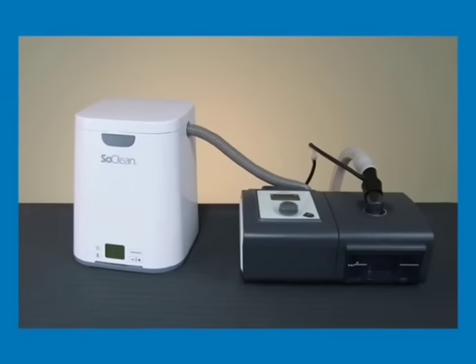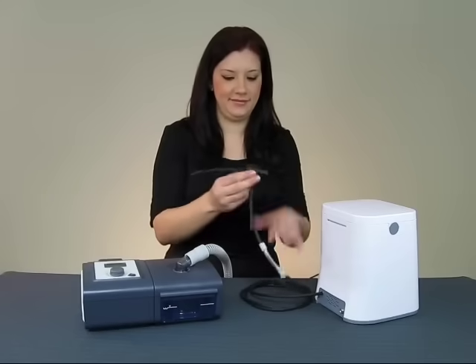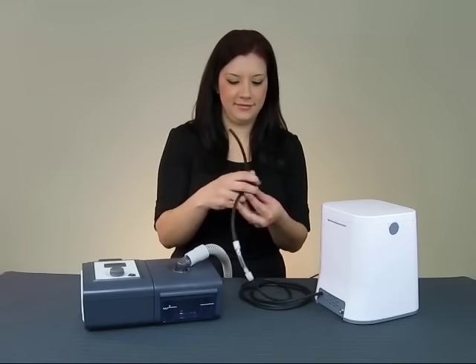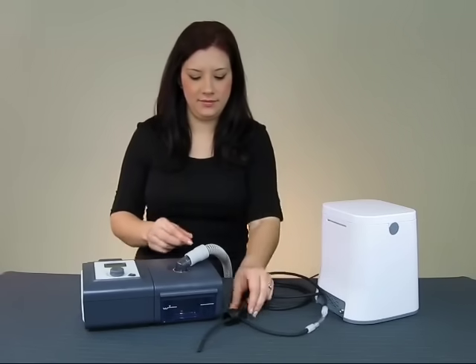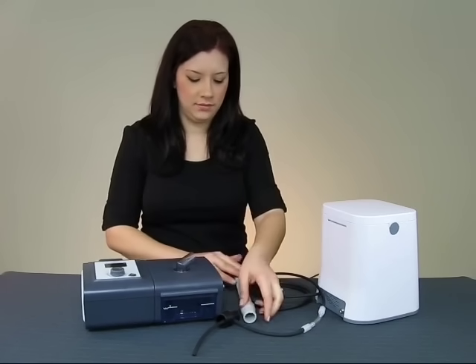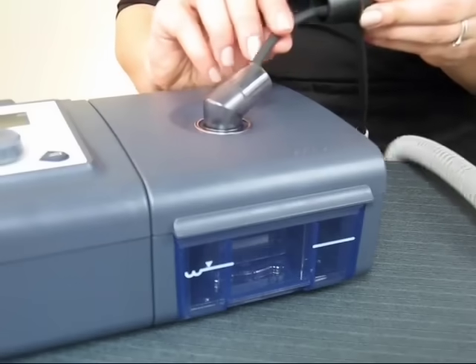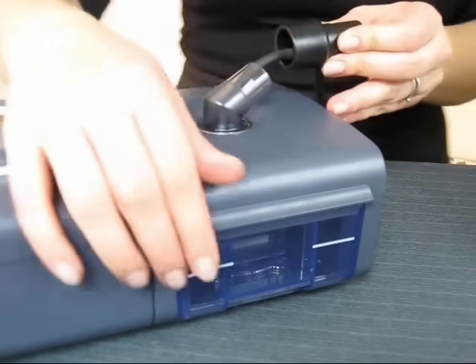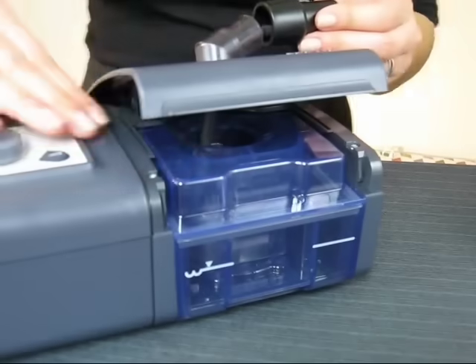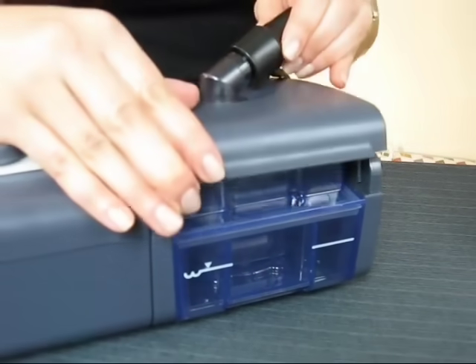The injection fitting establishes the link between the SoClean and your CPAP equipment. This fitting comes attached to the SoClean by a long length of hose. It also has a shorter length of hose coming from its interior. This shorter hose gets inserted into your humidifier tank. Do this by removing the main CPAP hose from your humidifier port and feeding the small hose in through the opening. Continue feeding it until the black plastic fitting is firmly in position on the spot where your main CPAP hose once attached.